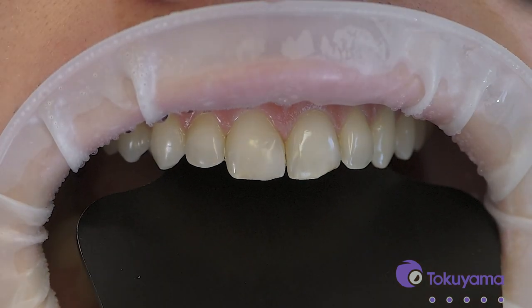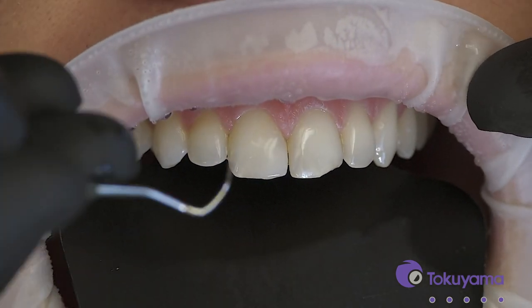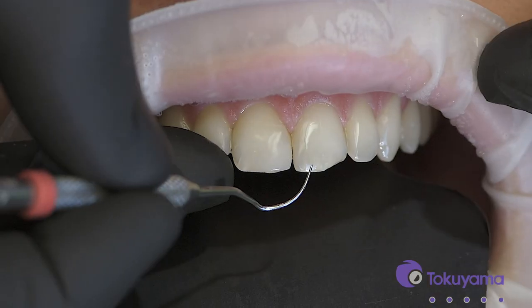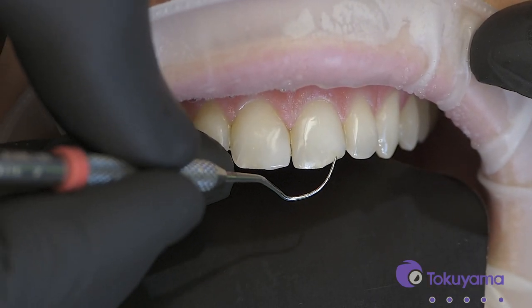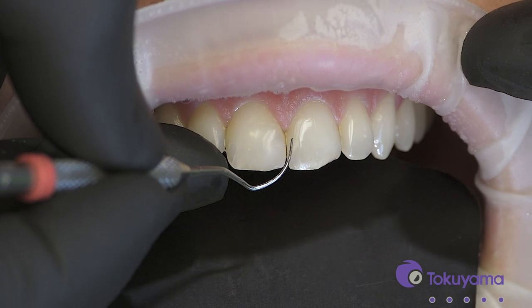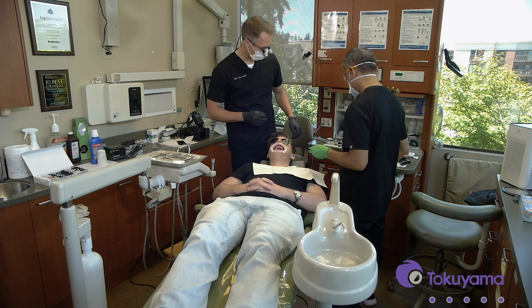Now, to make sure that we get a perfectly seamless restoration, the composite is going to need to be adapted and feathered beyond where we anticipate it to be, and then as we finish and polish it back, that'll bring it to where we think it'll end up. We have this lightly roughened surface from the drill where we did the bevel, but beyond that it's still smooth and shiny enamel. So we're going to use air abrasion to lightly micro-etch beyond the drilling part — not removing tooth structure, just making sure we have a nice clean enamel surface with no plaque or bacteria.